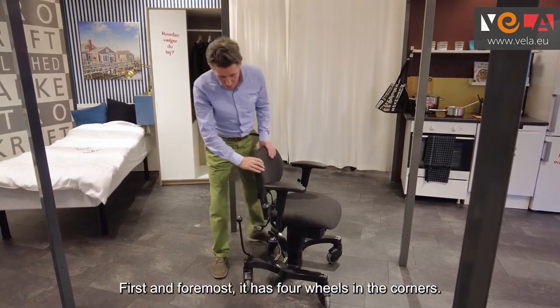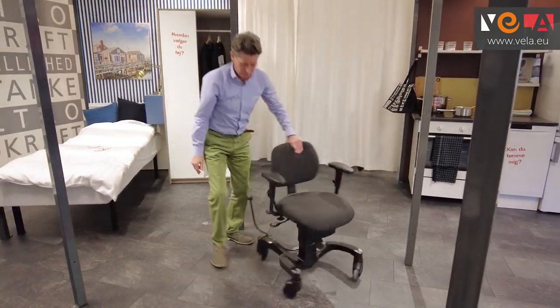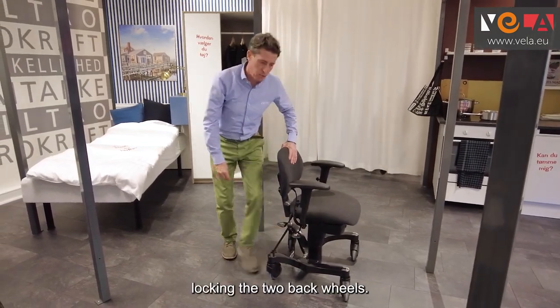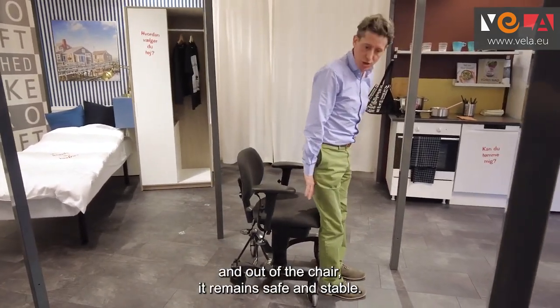First and foremost, four wheels in the corners, giving us stability and the ability to walk the chair. We have the braking system locking the two back wheels so when you're getting in and out of the chair it remains safe and stable.